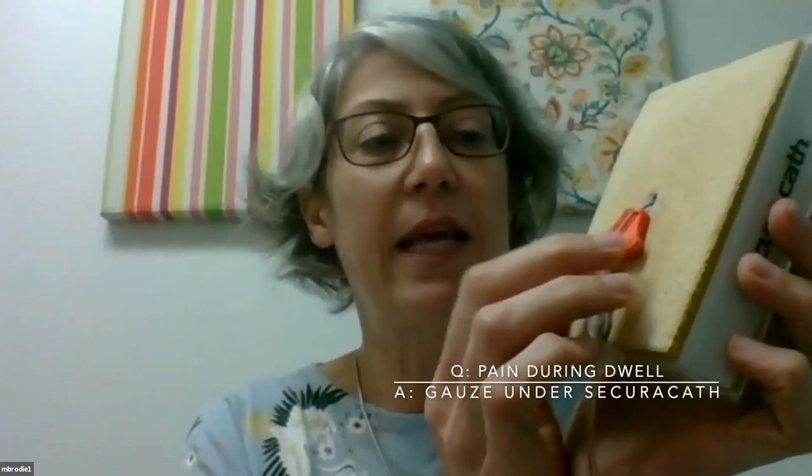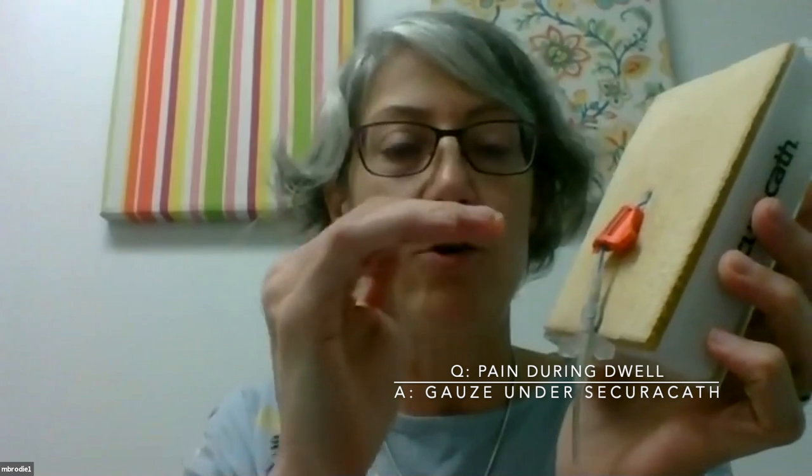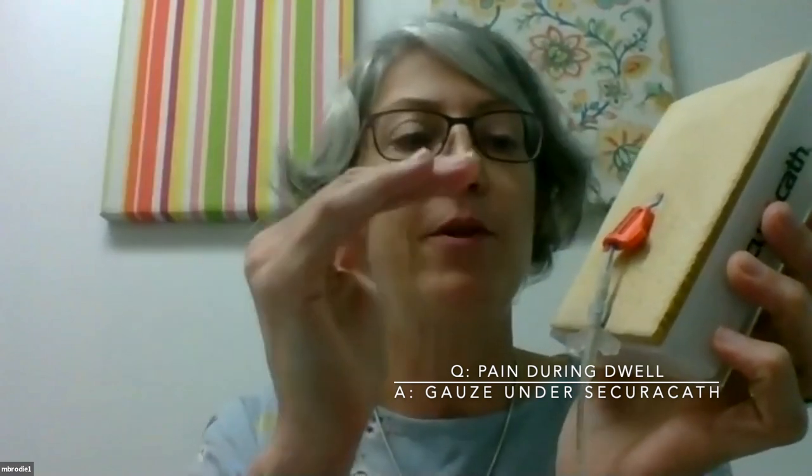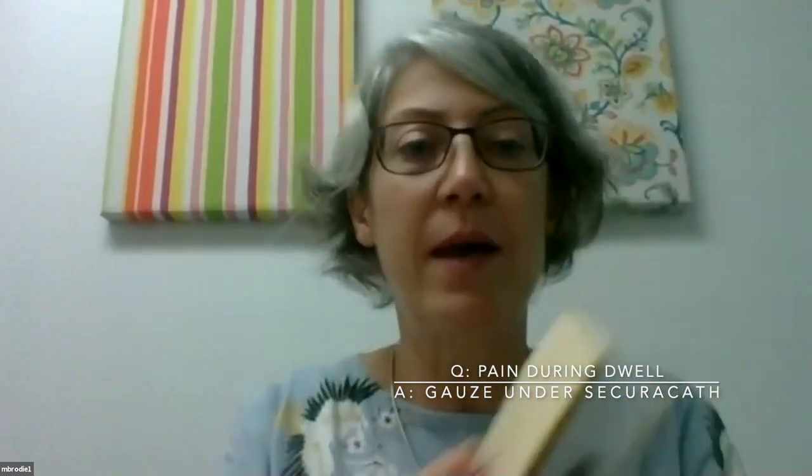What we sometimes do is just take a 2x2 and put it under the SecurAcath to lift the tines down, or the feet down. I keep calling them tines, but they're kind of feet. Sometimes that makes it more comfortable for them. But in general, we find it to be very well tolerated.